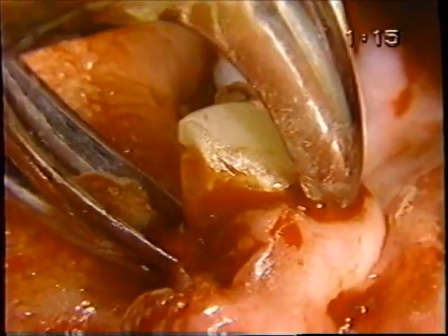But let's expand it a little bit. Buccally, lingually. And then rely on some rotational, and then finally some unscrewing figure 8 forces. Whenever I hear those sounds, I think, oh, do we have a root tip down there? We will see.